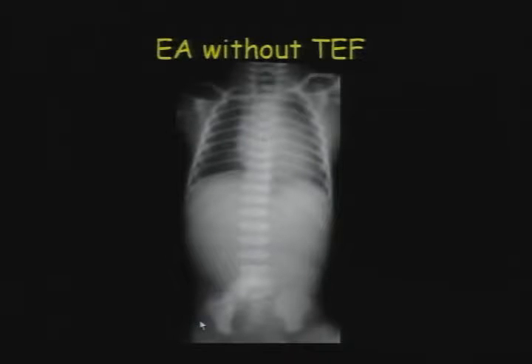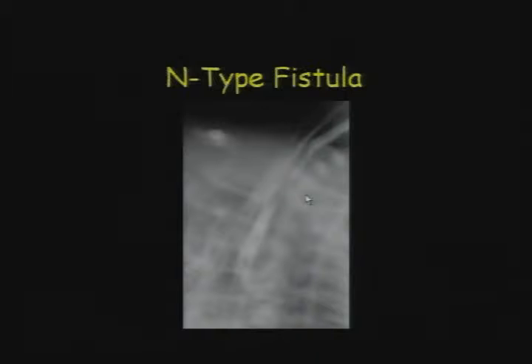You can have esophageal atresia without a tracheoesophageal fistula, and one place that's more common is in Down syndrome. And the way that you know that you have that is here's that esophageal catheter up in this dilated proximal pouch, but you have a gasless abdomen. There's no way for air to get into the stomach. That is also associated with other atresias, so as you start to evaluate those kids, you need to be looking for further down, duodenal atresia, small bowel atresias, etc.